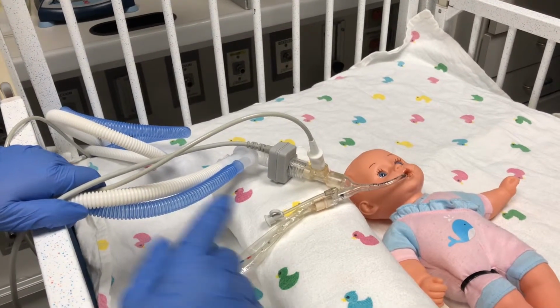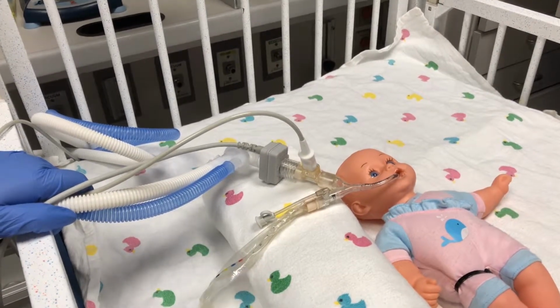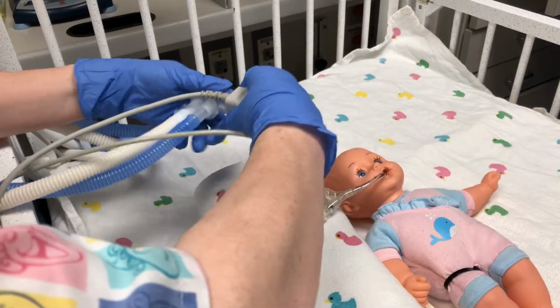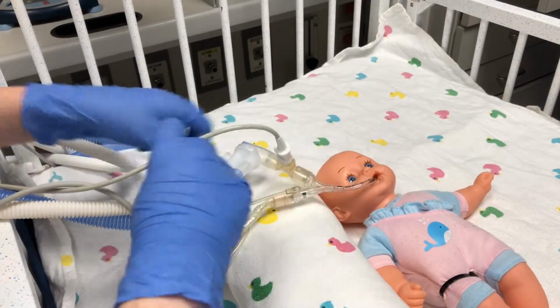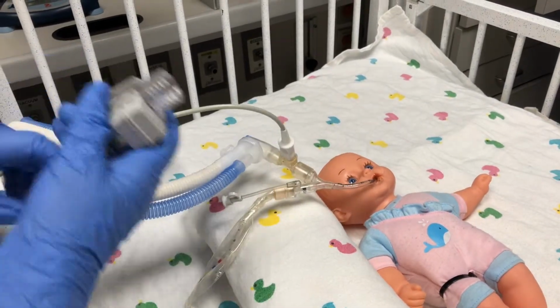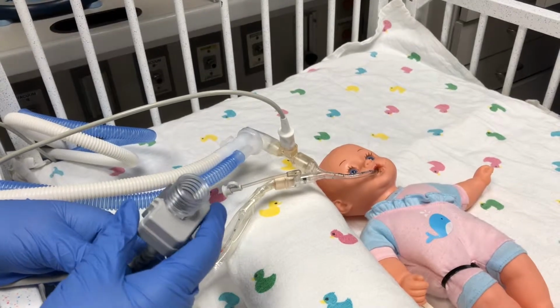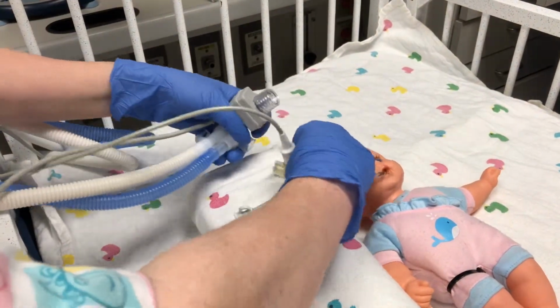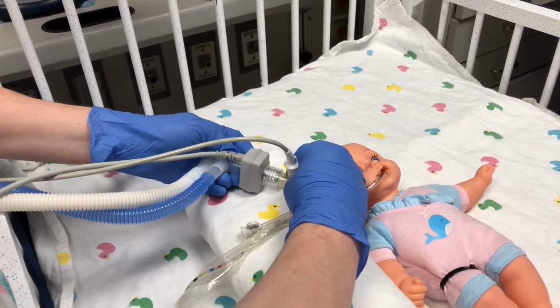Once a shift, you need to calibrate the adapter like was shown in the initial setup, where you're going to have to take it out of the circuit, and then you'll calibrate it on the monitor the same way that you did for the initial setup. Once you do that, then you'll just put it back in line. And that just has to be done once a shift, unless the sensor is saying that it's not reading correctly.